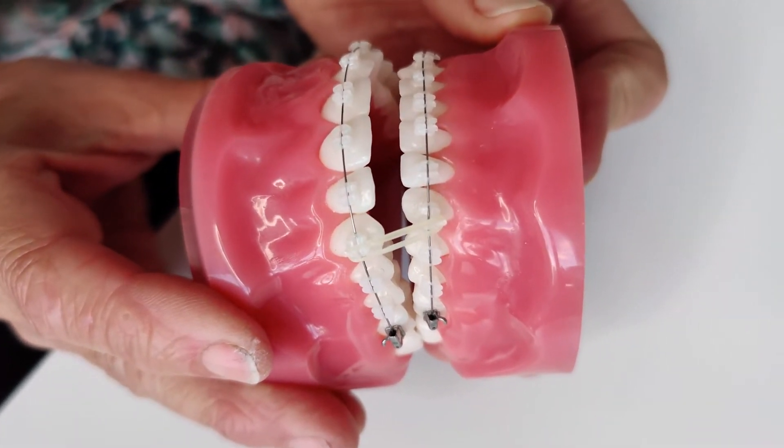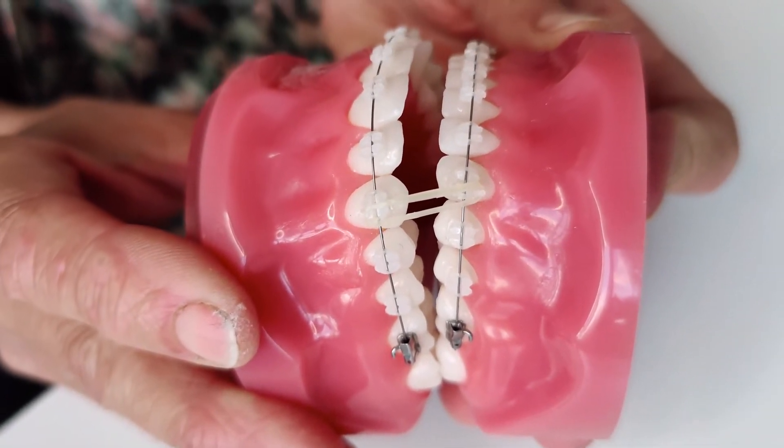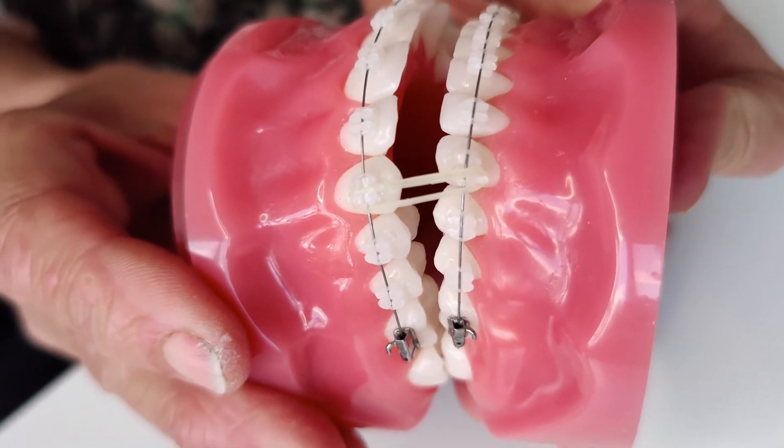Anterior elastics are used to correct the bite. They go from the upper canine to the lower canine. Little hooks are located on either side of the bracket, as you can see here.